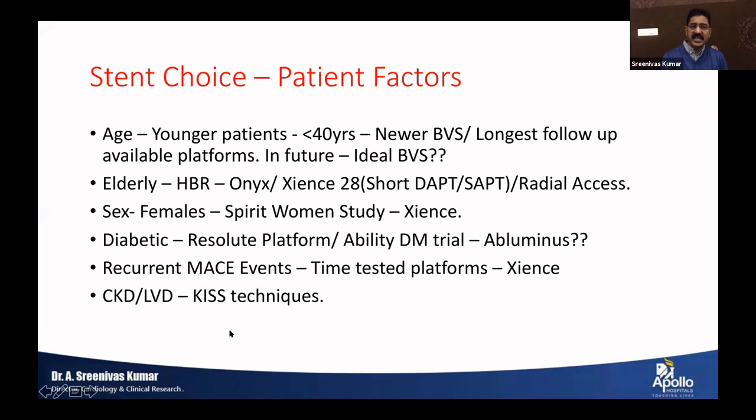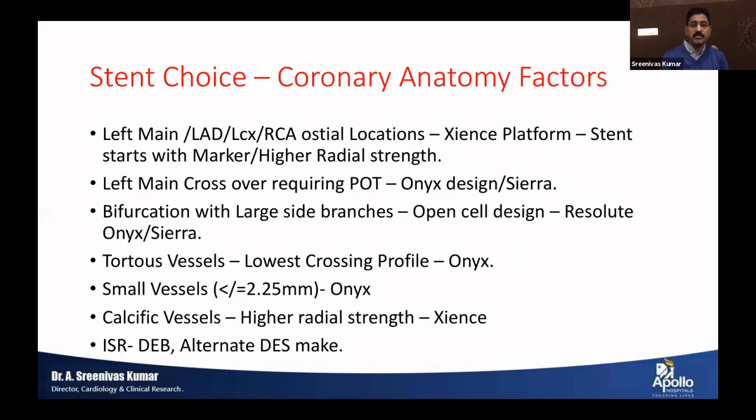And if the patient has CKD or LV dysfunction, try to keep the technique simple, don't put too long stents, try to limit the size of the stent, and try to do a quick job and come out without getting into too much trouble, too much contrast.